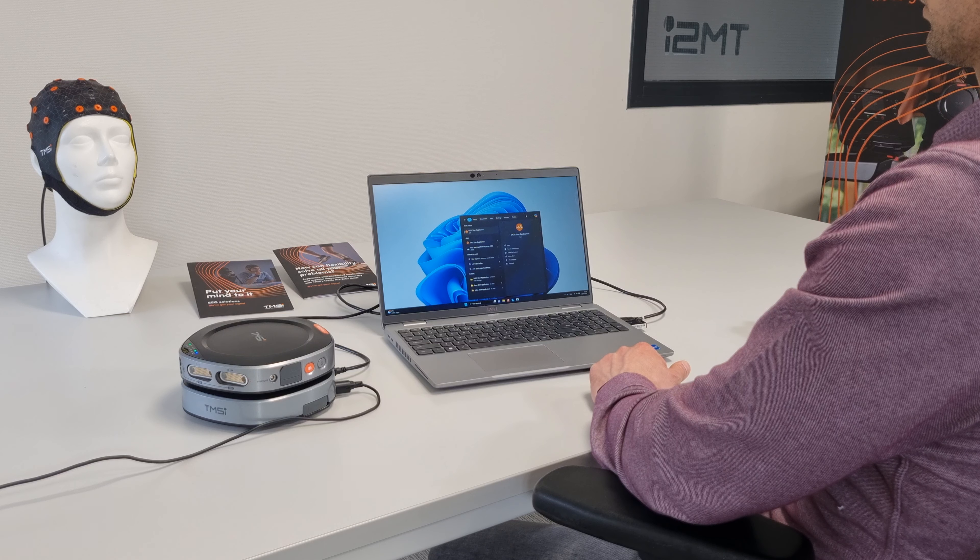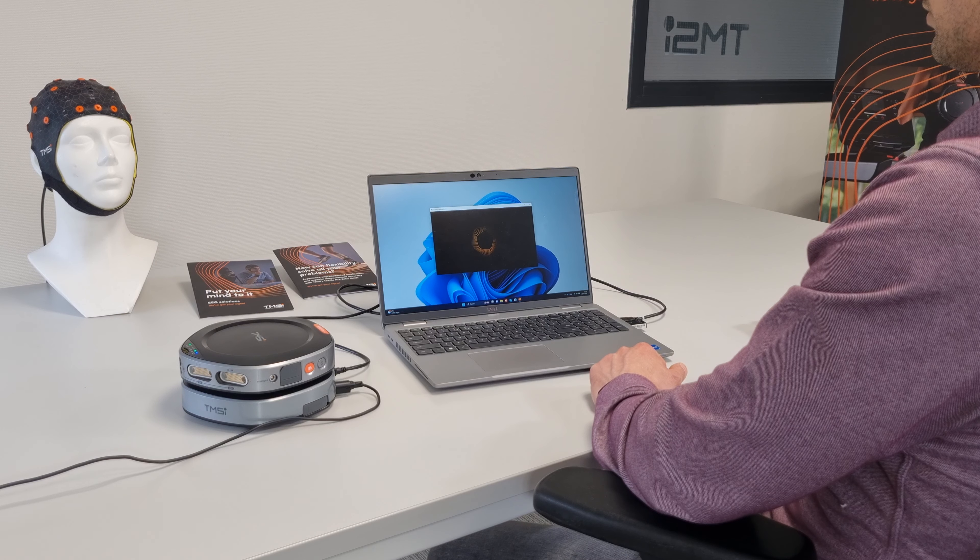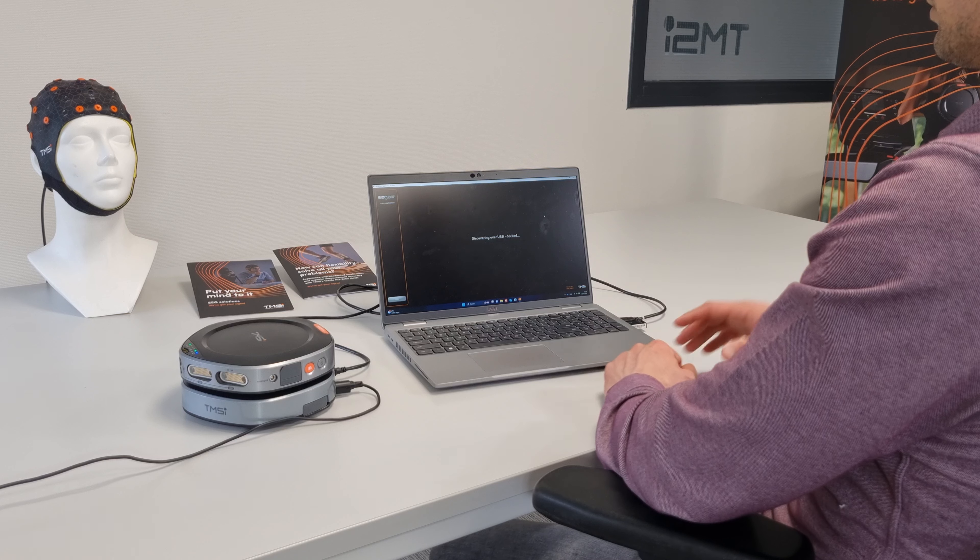Now the startup is complete and you can connect your device via the PC. You can easily connect your device by opening the Saga user app. It will automatically search for a device and connect if found.